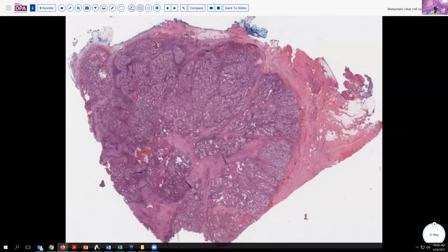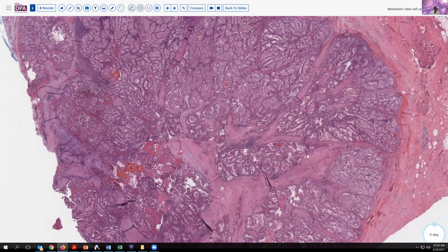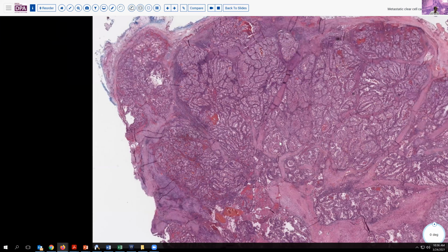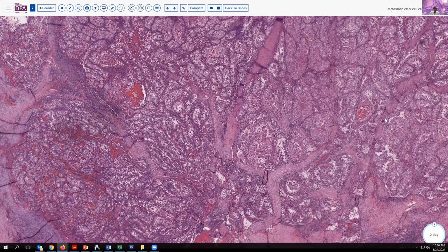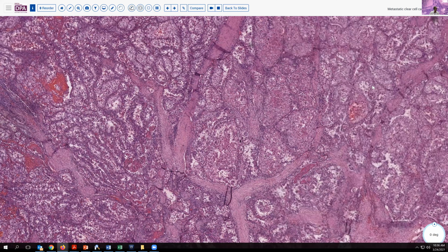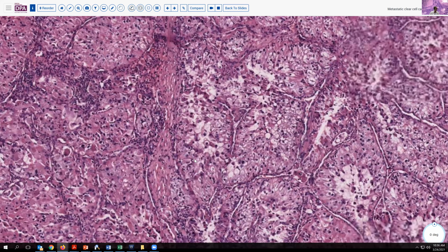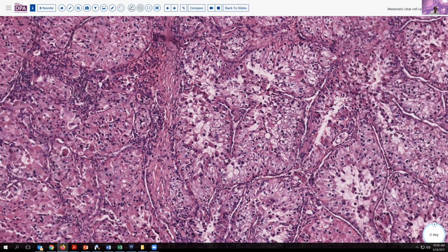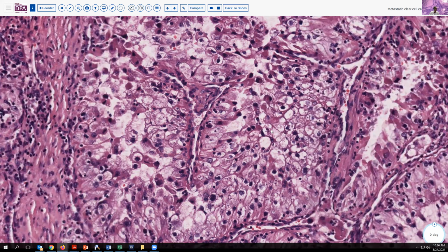So here's another pattern, more cellular tumor, a bit lobulated, with maybe a suggestion of necrosis or hemorrhage in this tumor. And as we come into higher magnification, we can appreciate that some of these cells have fairly clear cytoplasm, very distinct cell borders for many of these cells. And by golly, you say, well, you can have clear cell carcinomas in the ovary, so this must be a clear cell carcinoma of the ovary. And it's surrounded by subtending vessels and so forth.